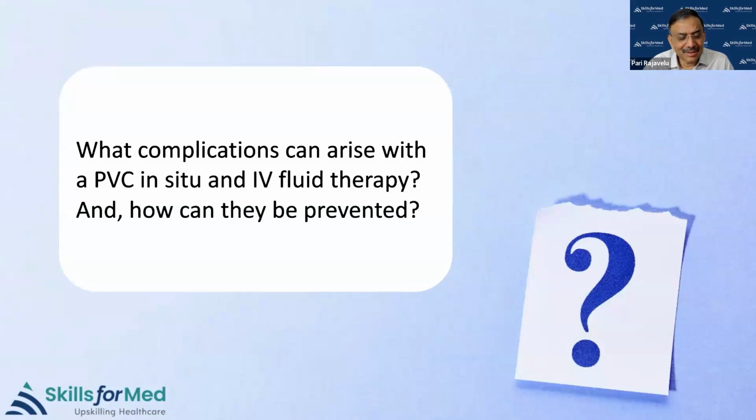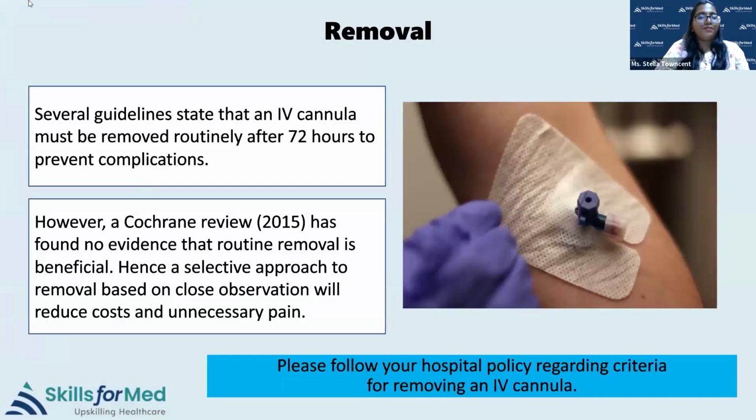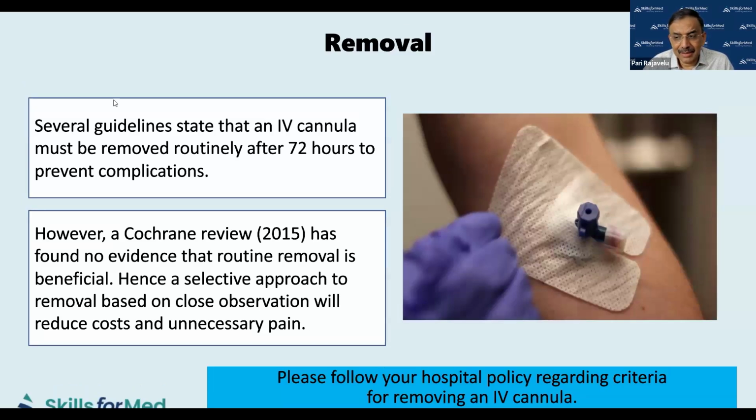Can you go to the previous slide? Yeah, here's the one. See, one thing you have to remember, NABH does not mandate anything about cannulation. They only give you certain guidelines, but many people will say NABH mandates. NABH is only an accreditation body, and it will point you to certain guidelines. But somehow the NABH assessors, and also the NABH consultants who help you get accredited, say 72 hours, and it has come into practice.